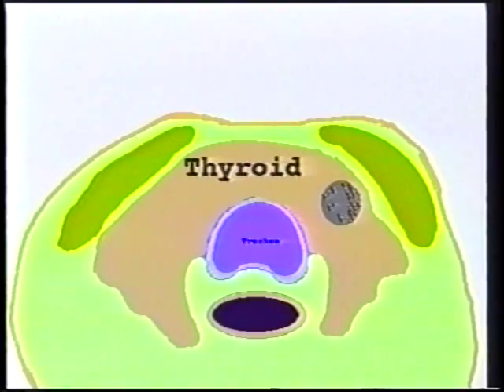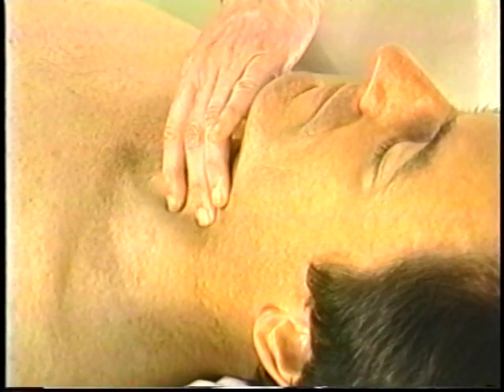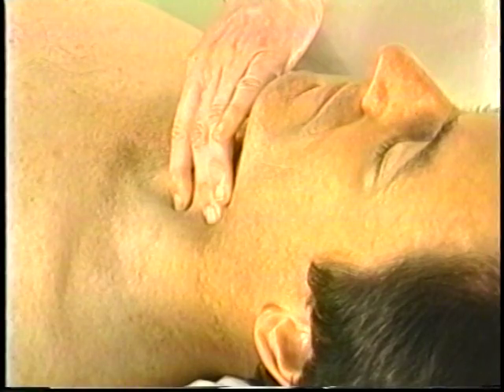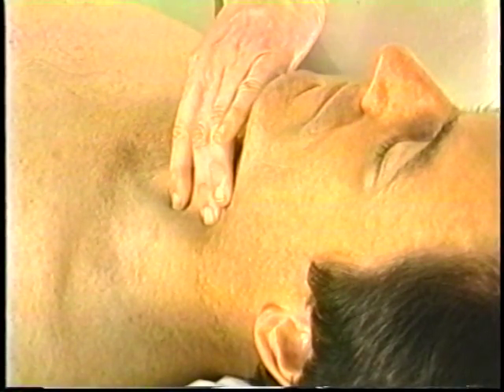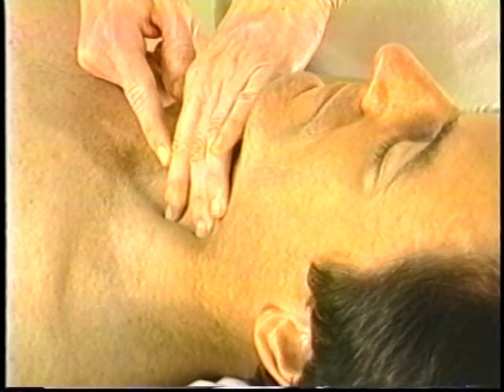The second is stabilizing the nodule. Most nodules will be adjacent to the trachea, and the trachea therefore can be used as a support. The easiest way to hold the nodule is to use the fore and middle fingers on each side of the nodule, pressing against the trachea. If the nodule is large and extends laterally, make sure it is not covered by muscle. In order to push the lateral muscle aside, place the fingers medial.